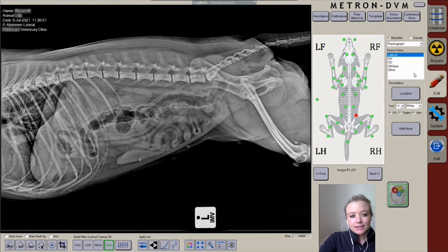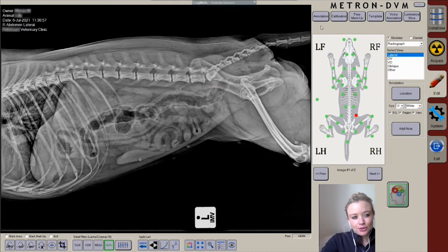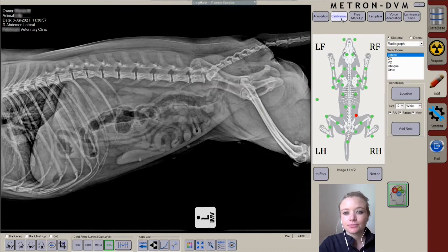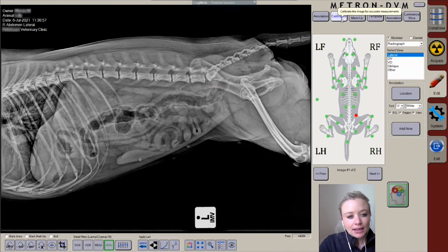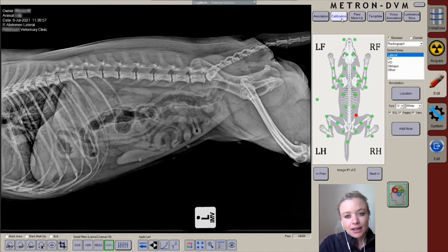Edits is also where you undertake your measurements and add annotations to your radiograph. The Metron software is unique in that it requires you to calibrate your images before you can perform measurements. This is a strength of the software because it allows for very accurate measurements to be taken.